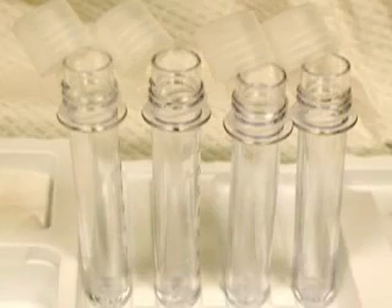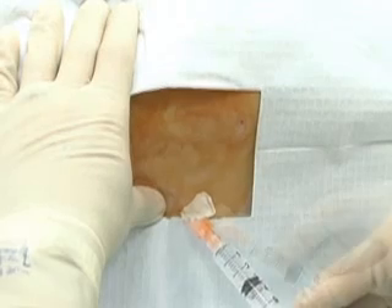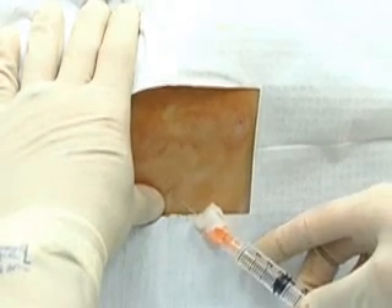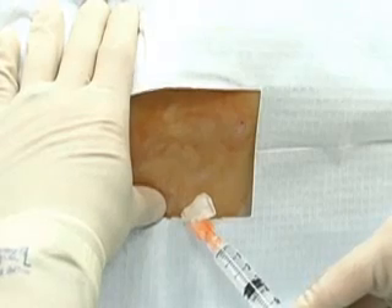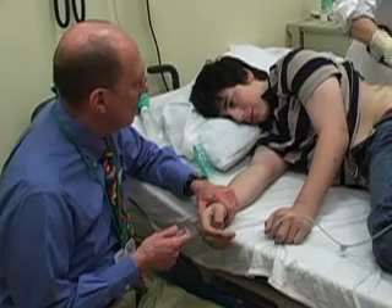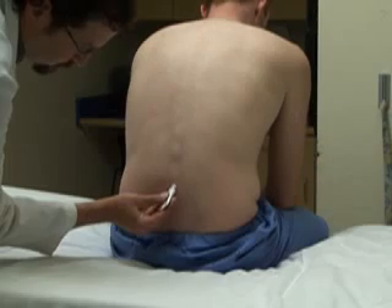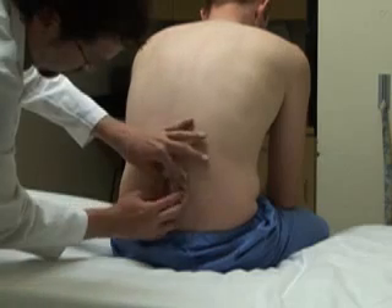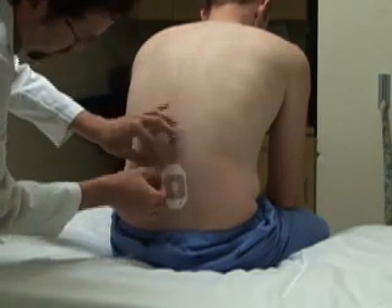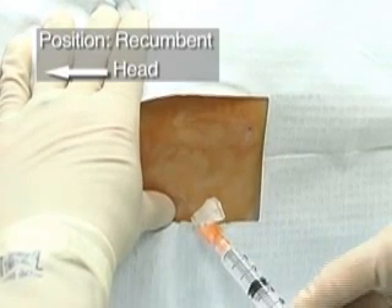Lay out the collection bottles in the order of priority for the diagnostic indications. Lumbar puncture is a painful and potentially anxiety-provoking procedure. At a minimum, the use of a local anesthetic is appropriate. Sedation or systemic anesthesia may be required under some circumstances. You can apply anesthetic cream topically before preparing the skin. After preparing the skin, you can inject local anesthetics subcutaneously.